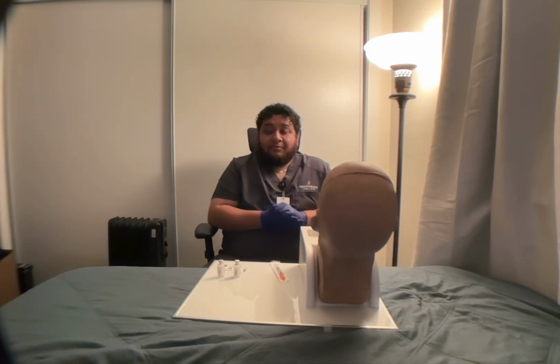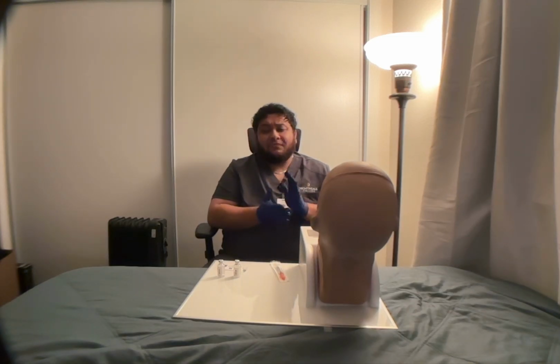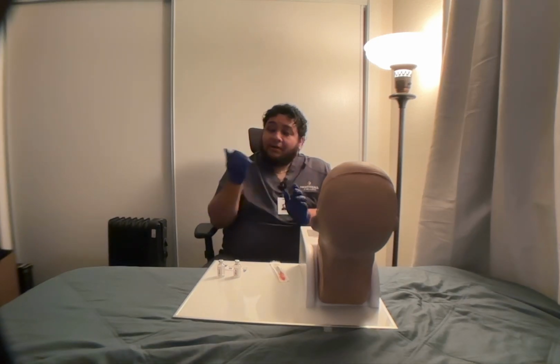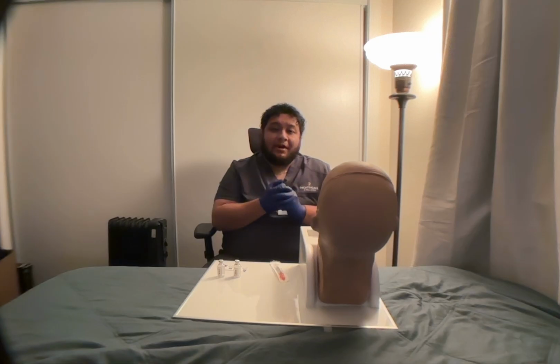In this case, my patient's blood sugar is 142, which is appropriate for insulin administration. My patient's next meal will be served in about 30 minutes. Okay, let's move on. Now I'm going to verify the MAR again. I'm going to call another nurse for the whole process to verify with me. The order is confirmed: 4 units regular insulin and 8 units of NPH. That amounts to 12 units total.